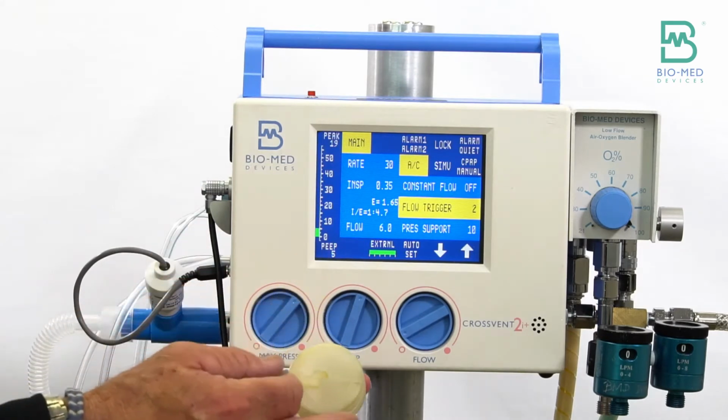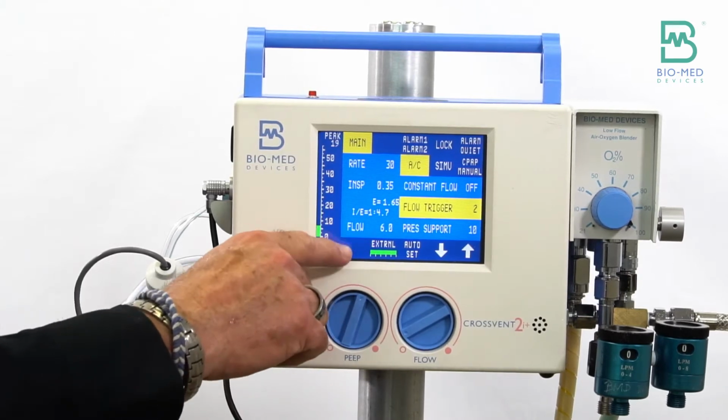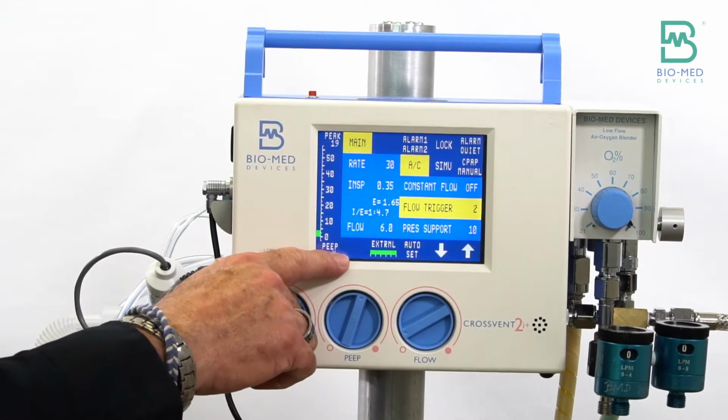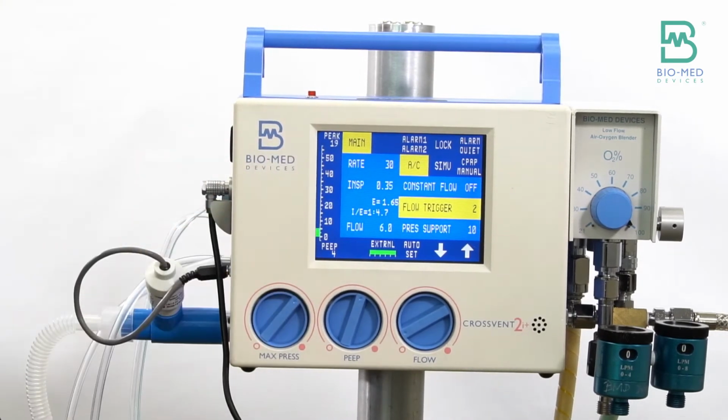So now the patient is actually triggering the vent. And you can look right here at this space where it shows you what's going on. Control, the vent is cycling at a rate of 30. If the patient actually triggers, you see assist, assist.